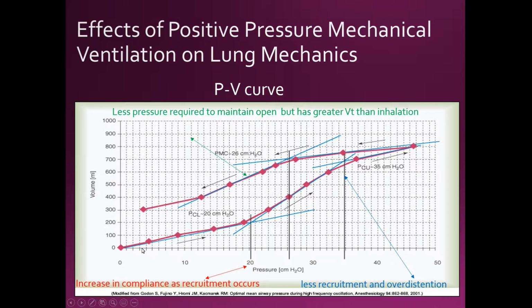And also here, as you start increasing in pressure, right when you see a little bit more of a steep curve, this is where your alveolar recruitment comes into play. So imagine that you're at 0, you're adding pressure, 10, nothing. So it's starting to go up to 20. Right when you hit 20, instead of just going straight out this way, it's a sharp increase. That is when you have your alveolar recruitment happening. Okay.